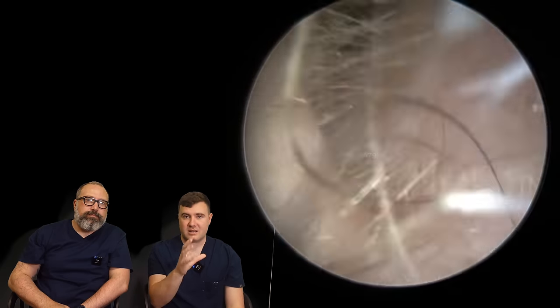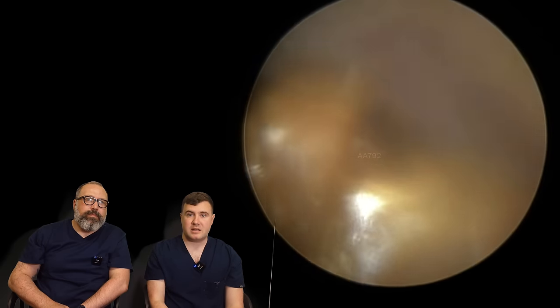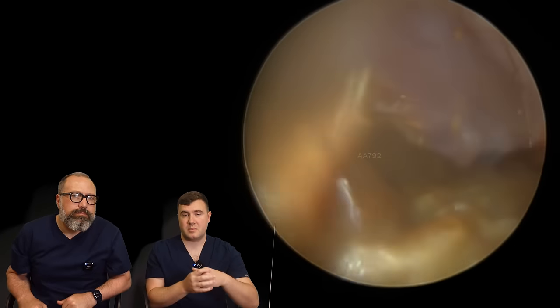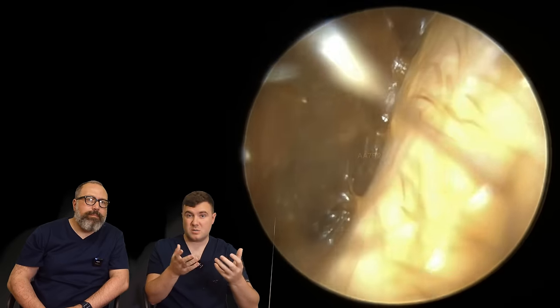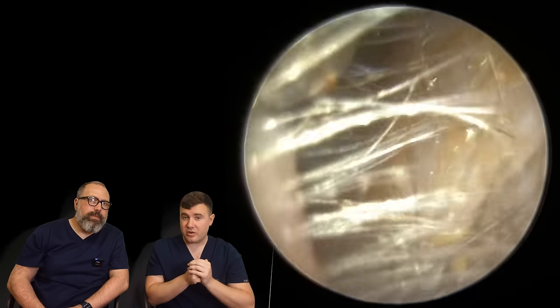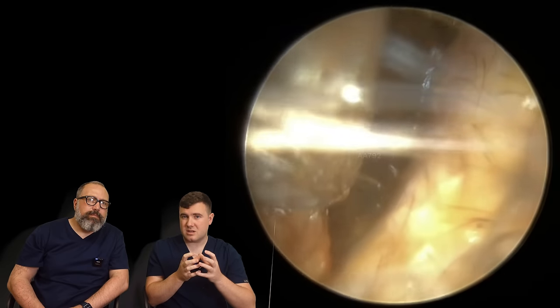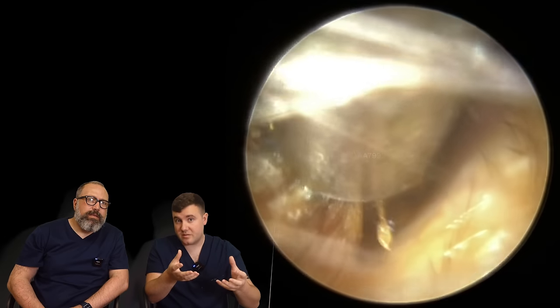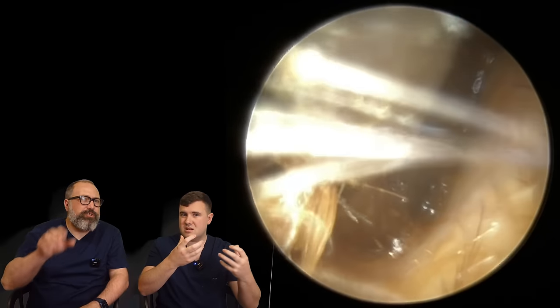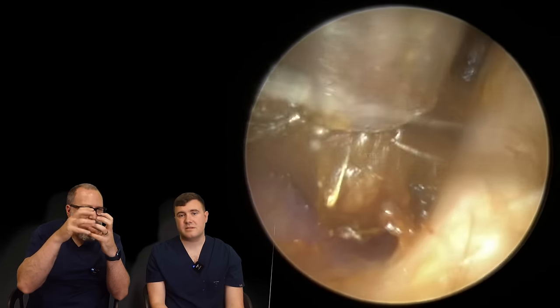So much better. Still little tiny spots here and there, but the patient did really well to sit through that slight pressure we had to put on that plug. As always, we would normally recommend this patient, like most patients, to continue the use of olive oil about once a month and have some regular check-ups as well. You can just about peek the eardrum on this side — it's a lot softer as well. A lot more oil has actually gone into this side, so it's penetrated into this wax. That really hard, dark colour wax doesn't always let oil penetrate — it's just such a tough surface.